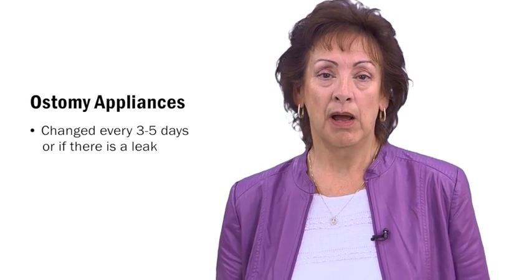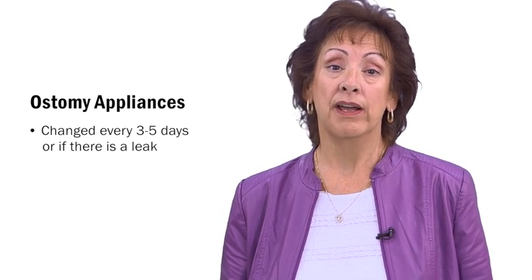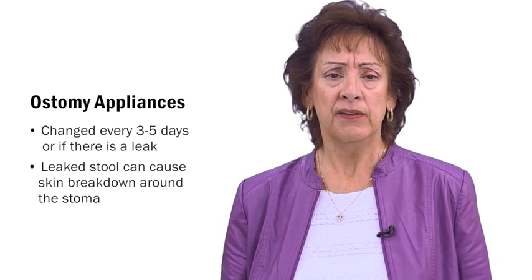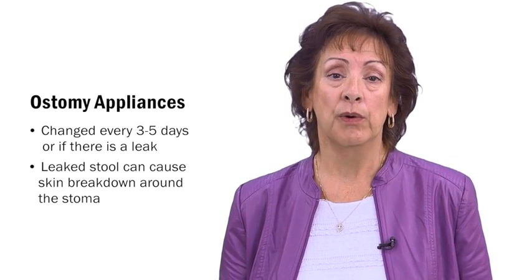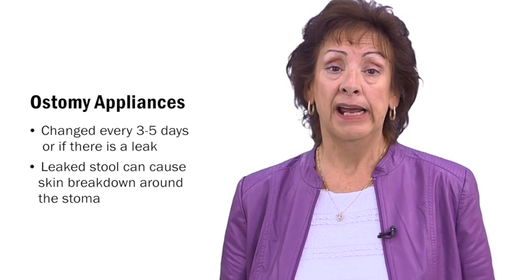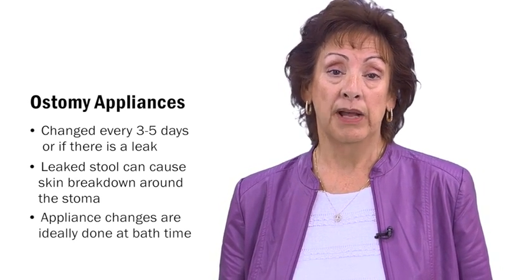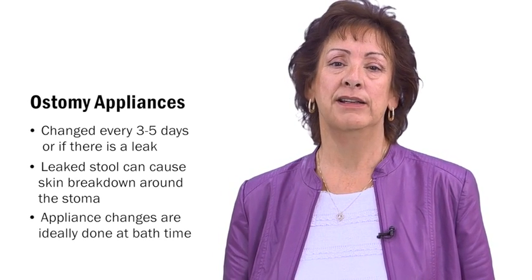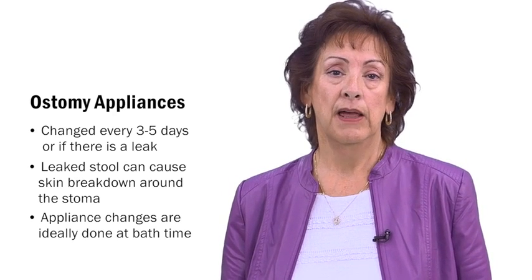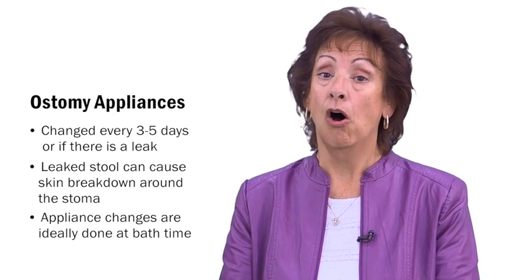The ostomy appliance is usually changed every 3 to 5 days, or if there is a leak. It is important to change your appliance when there's a leak, as the stool coming in contact with the skin can cause skin breakdown around the stoma. Appliance changes are ideally done with baths. Your child may bathe with the ostomy appliance on or off.